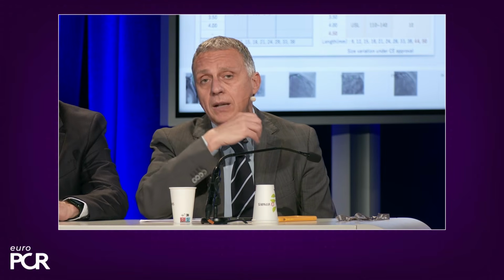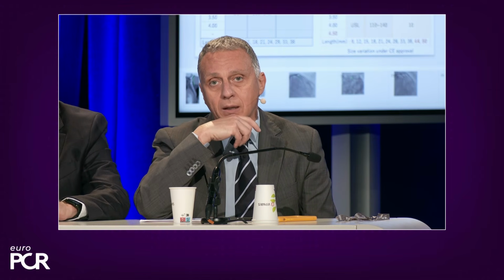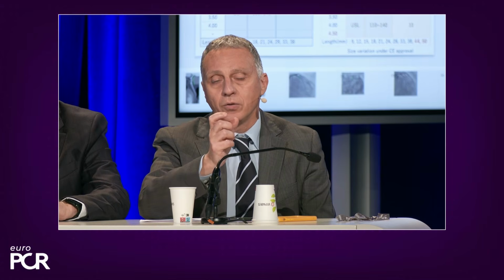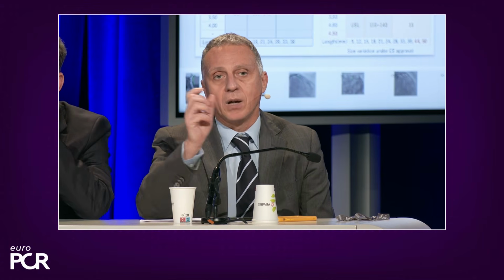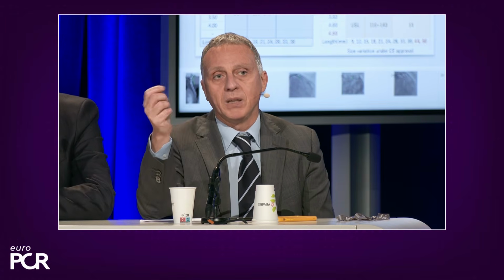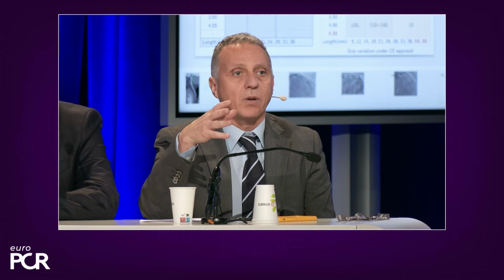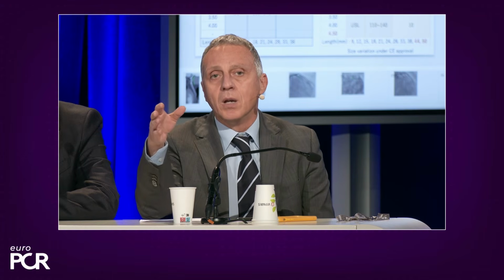So there is no final answer for that. For sure, before embarking in not covering the ostium, it is very important that you are 100% sure that your landing zone has been appropriately selected, and intravascular imaging can help you.